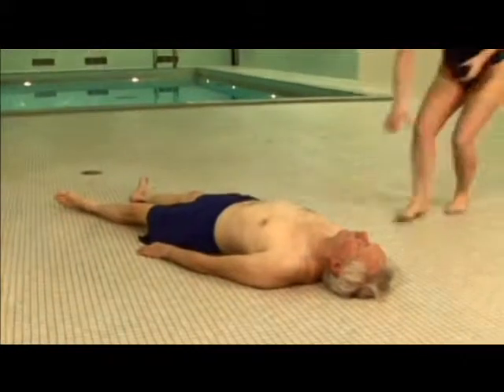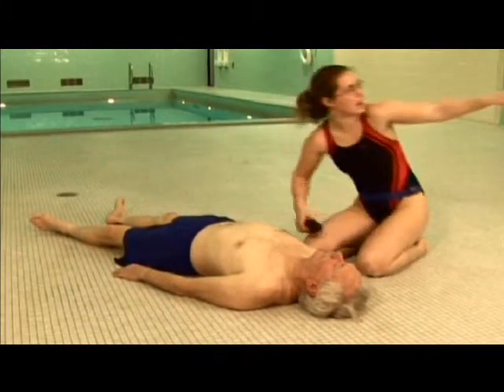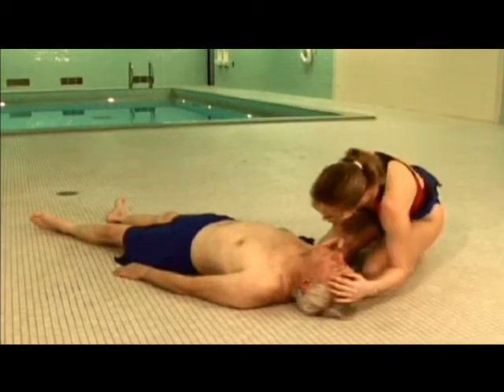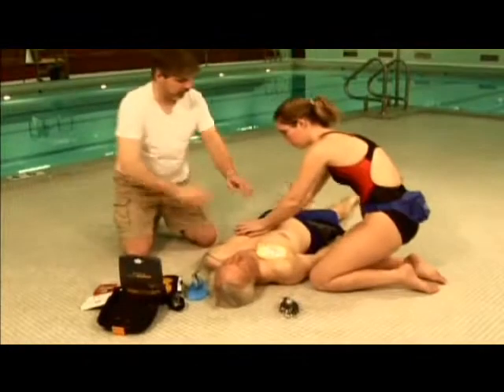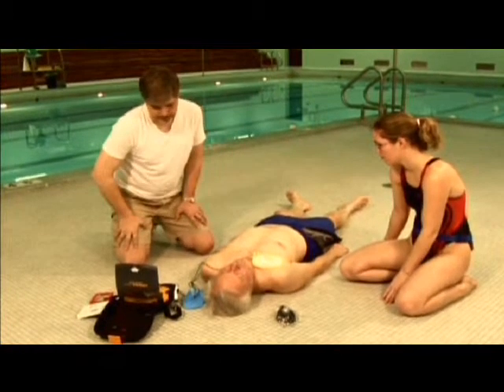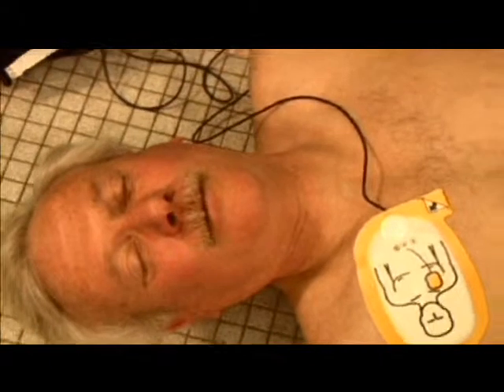Whenever water is near a victim of cardiac arrest, move the victim quickly out of standing water, dry the chest, and apply the electrode pads. As long as the chest is dry and the pads are firmly attached to the chest, risk of shock to the rescuer is very low.